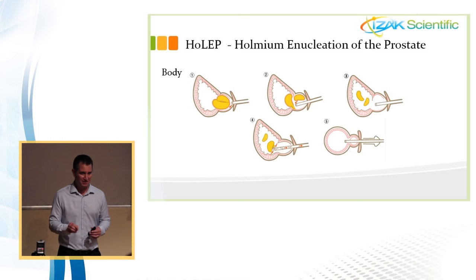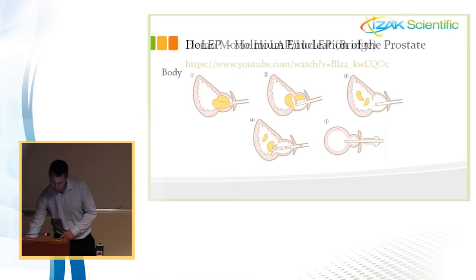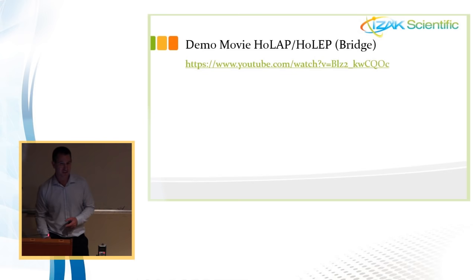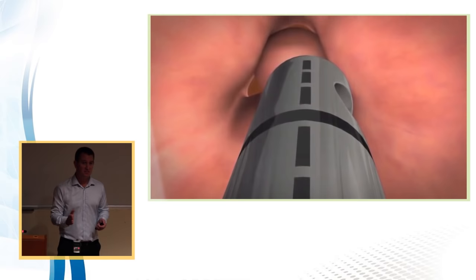Is it under some visualization? Yes, of course. It's with the cystoscope, so the physician sees everything in the movie. So you also see what he's doing. Yes, of course. It must be. Let me show a short demo, a movie from a very good company that sits very close to here in Yokneam. I used to work there in the past. It's called Lumenis. In this movie, we show a very short explanation of HoLAP and HoLEP. If we have time, there is a nice movie only on HoLEP.